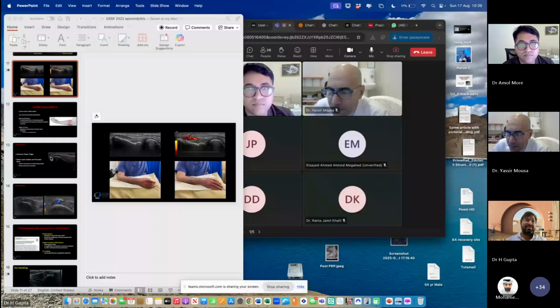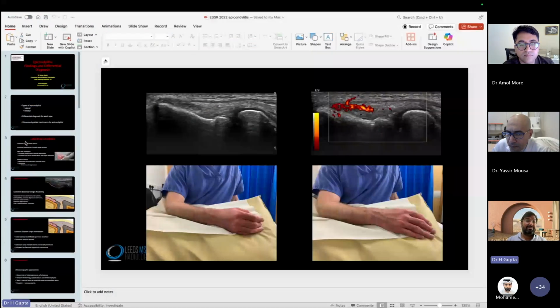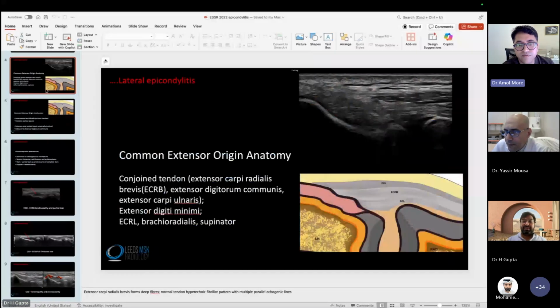Yes, Professor Harun. I absolutely agree with you. If you want to share one image, you can share, Professor Harun. I will, one second, if I can share my, one second. I will just very quickly share the, are you able to see my screen? Yes, we can see your This screen.